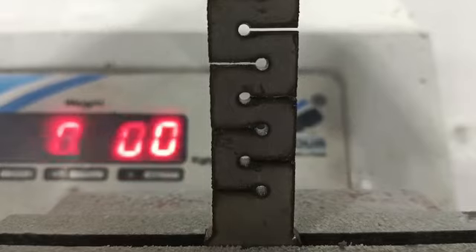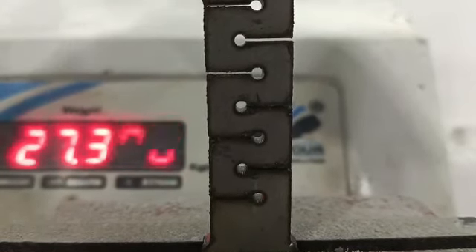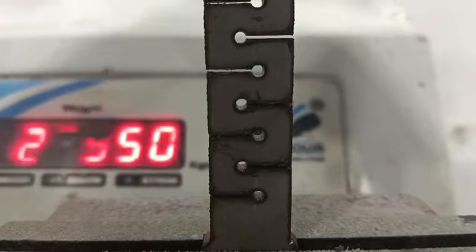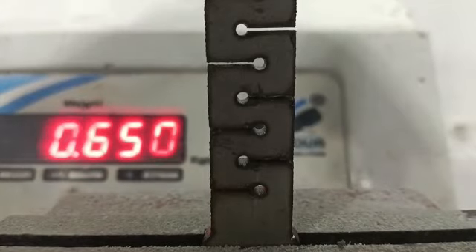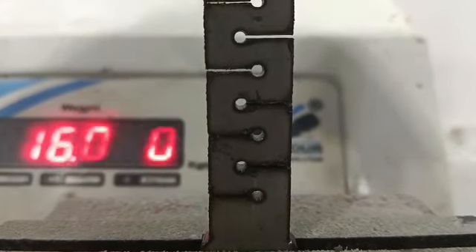Starting at 0. We apply the loading — goes up to 20 kg and back to 0. Again, 20 kg and 0. You can see the micromotion of this KELUS plate.